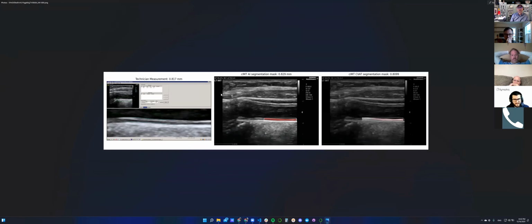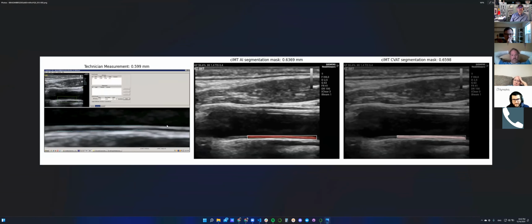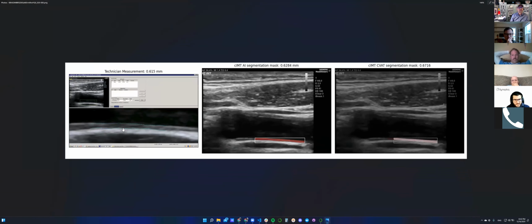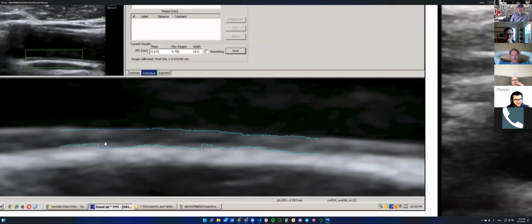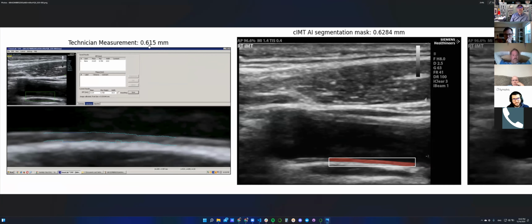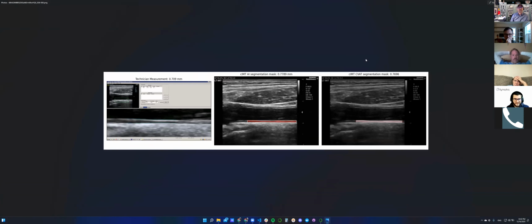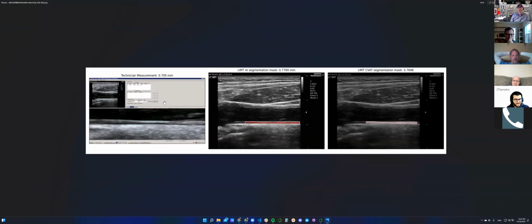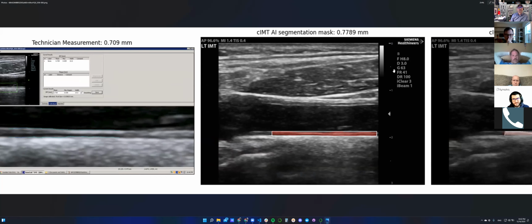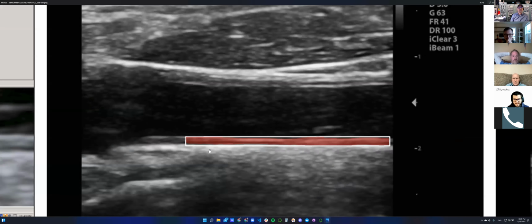But in other cases, like, let's find one. Yeah, for example, in that case, we see some ups and downs right here. So the measurement looks like 0.61, and here we get 0.62, which is like 1 pixel difference, right? So I don't think there is any significance in this small difference. But in that case, for example, the result is 0.7, but we get 0.77.